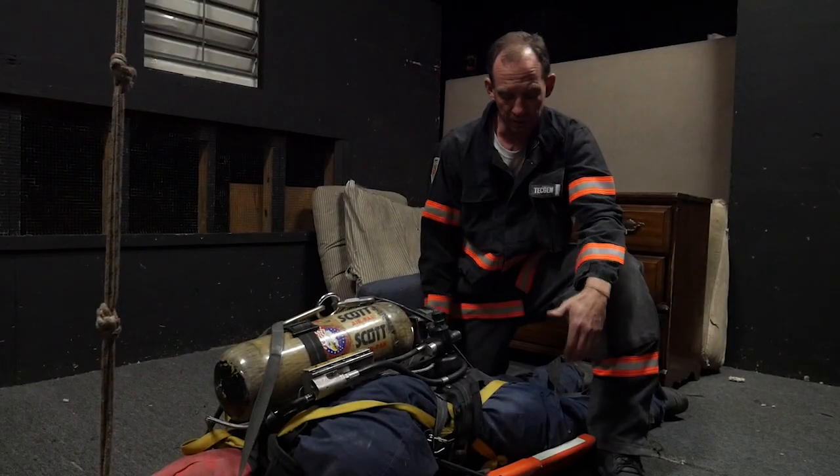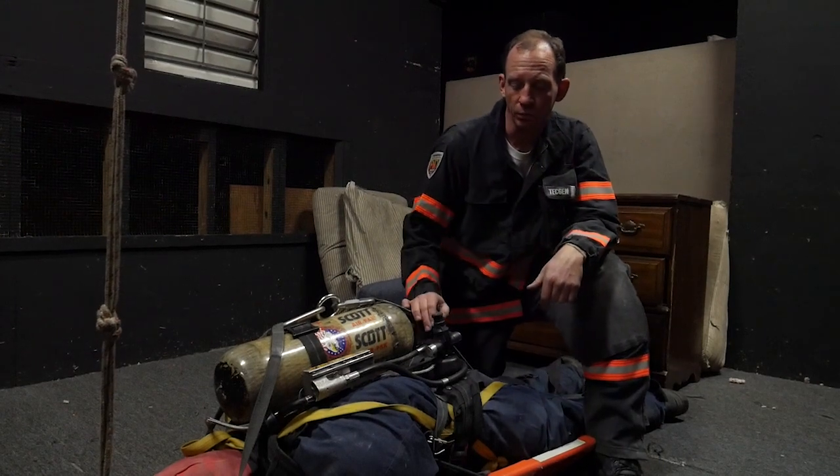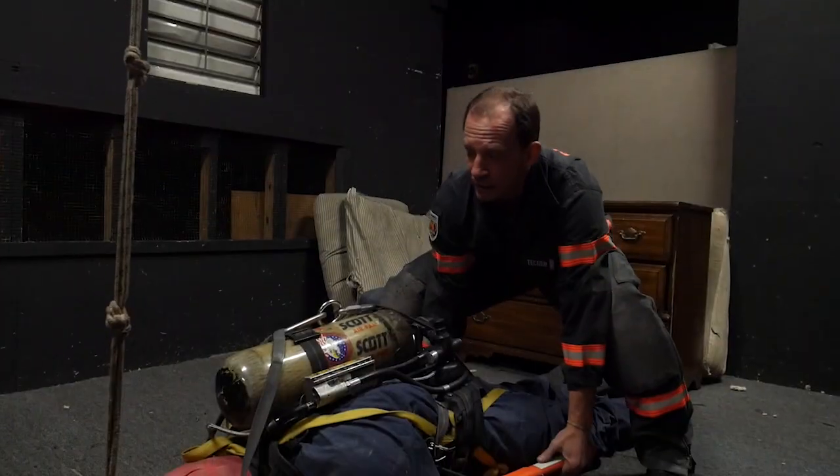Once we start lifting, I'm going to lift up the back of the board so I can make sure not to hyperextend the patient on the board. All right, ready to lift — lift.